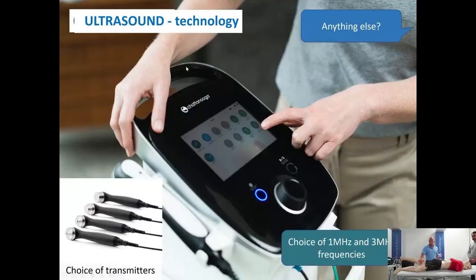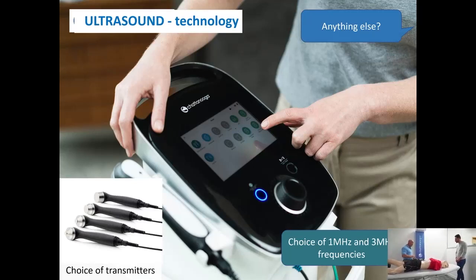Is there anything else? Okay, yeah, another important consideration is having a range of transmitters. So as I said, on my machine today I've got a 10 centimetre because I know I'm treating a knee. I've got a 2 centimetre because I also do a lot of hand therapy. A standard transmitter would be a 5 centimetre. Okay, so we have 4 different transmitters that you can then utilise around the body.